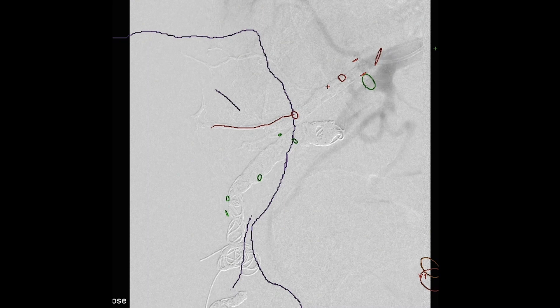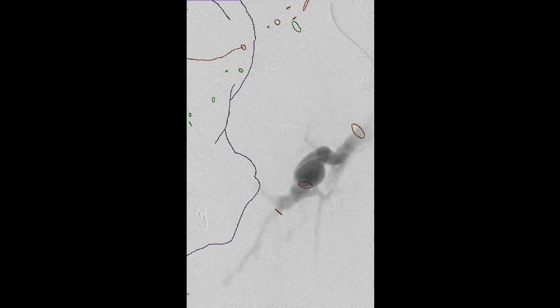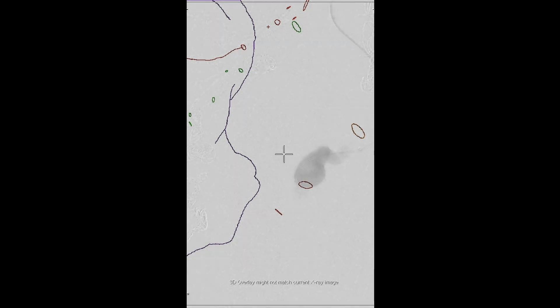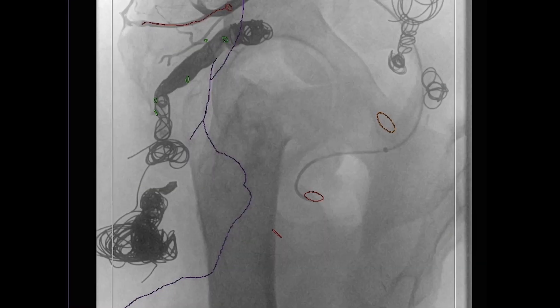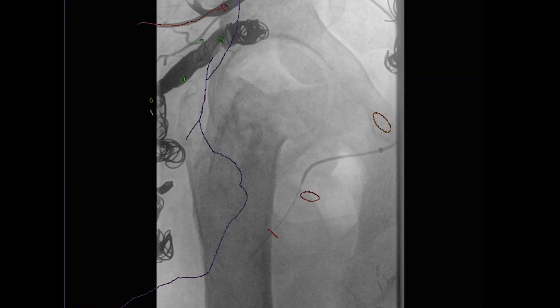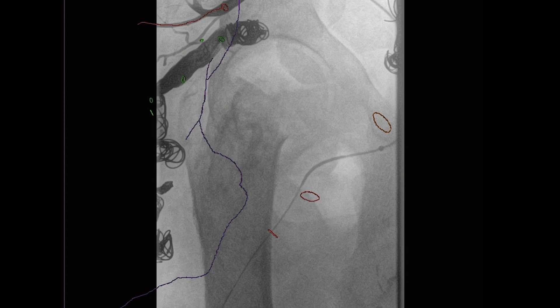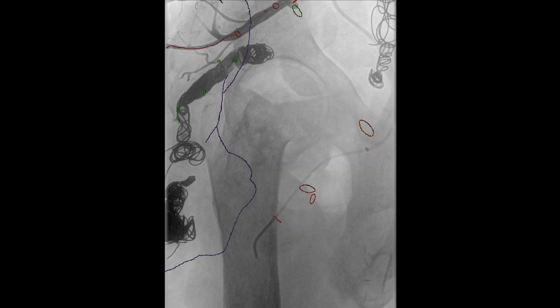We've taken out those other branches and everything is being repositioned. The catheter has been brought down into the profunda. You can see the profunda itself is aneurysmal — these tortuous abnormal-looking vessels really do look like malformation. There's a huge branch probably coming off the circumflex vessels.